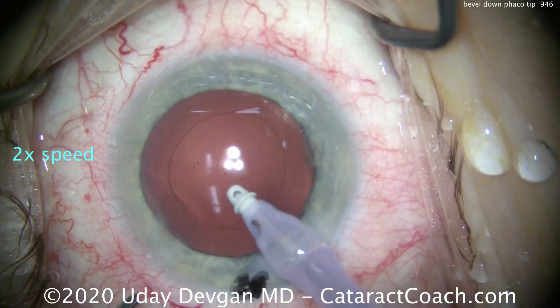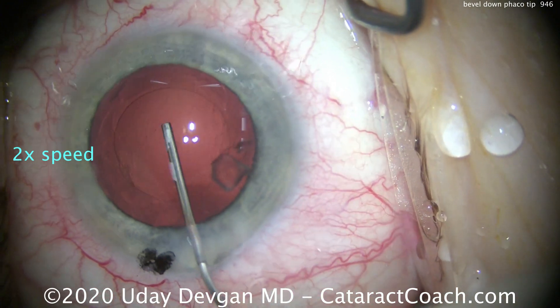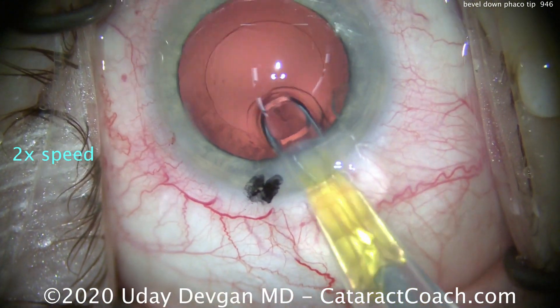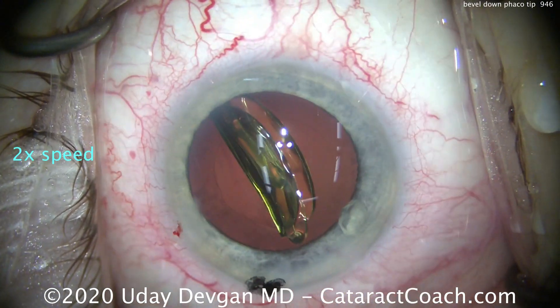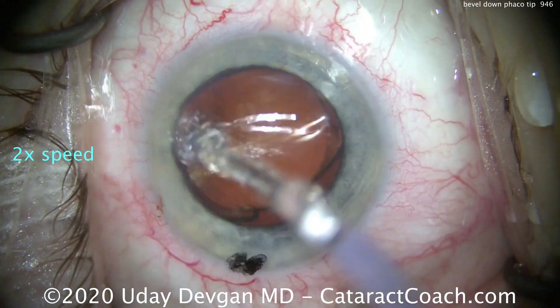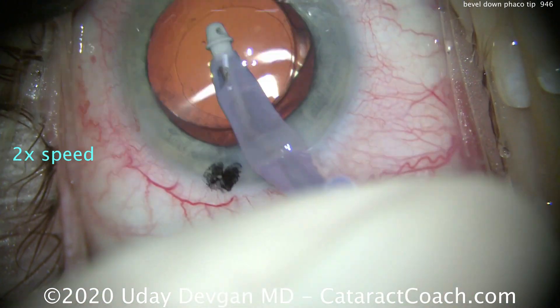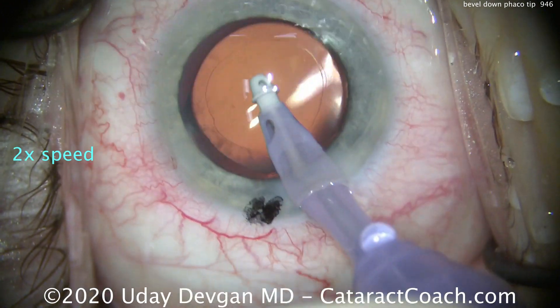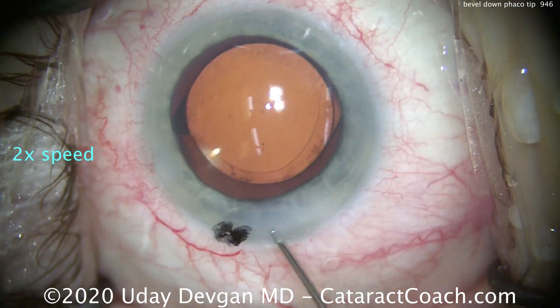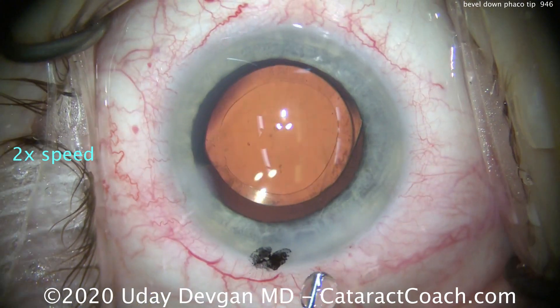If you don't hold the nucleus firmly with the phaco tip, it's very difficult to chop it. We've shown videos of other surgeons and even me where you can chop the nucleus without even using phaco energy, without even burying the probe in the eye — you just need two instruments directly opposed to each other and bring them together, and that alone will hold the nucleus in position while it's chopped. But for most chop techniques, remember the idea is cutting a steak: the fork has to hold the steak still while the knife does the cutting. In our analogy, the phaco probe with high vacuum has to hold the nucleus still so the chopper can cut or break up the nucleus. Achieving that high vacuum is what gives you the holding power, and high vacuum in a peristaltic pump is only achieved when the tip is occluded.